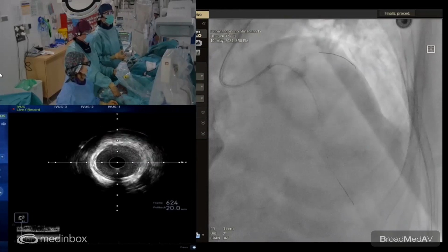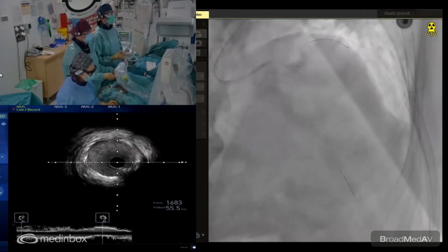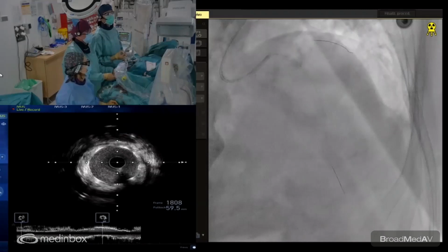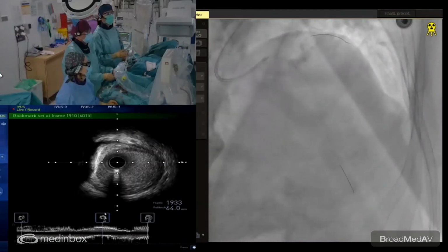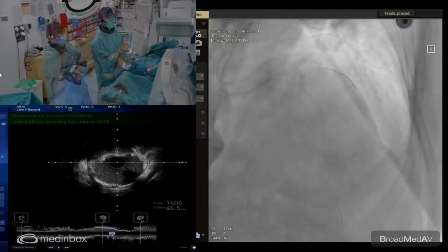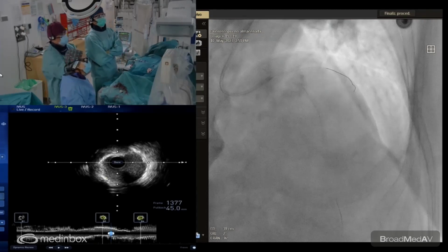This was the less calcified part, I think. Yes, the stent is not a circle at the more calcified plaque, but if the minimal stent area is over 5 or something like that, I think the result is quite good. The proximal part of the stent is also okay. There, I think it is, but for sure over 5 or 5.5.